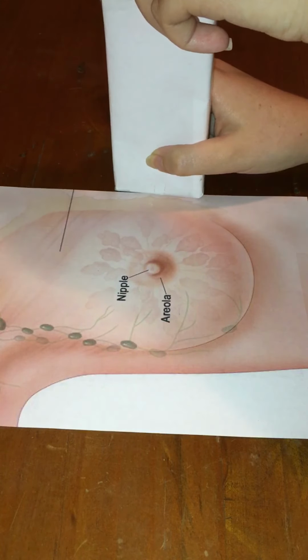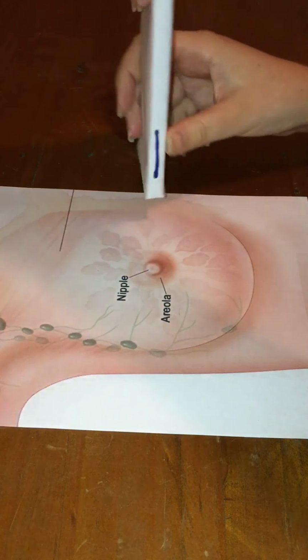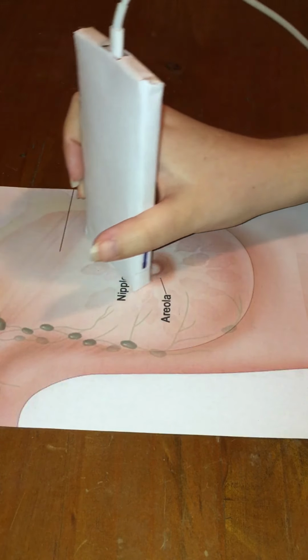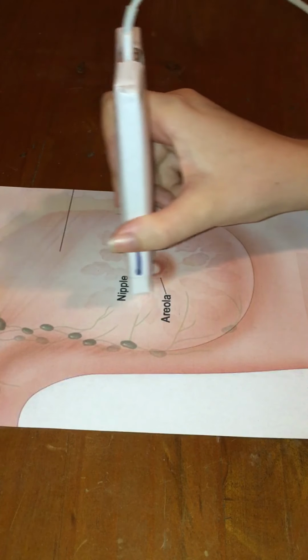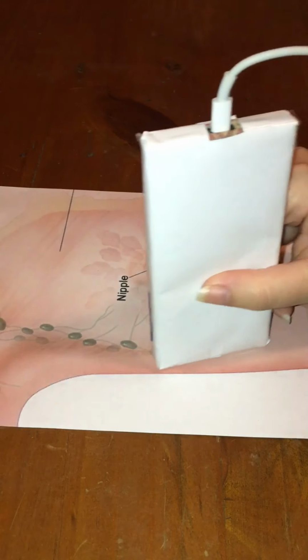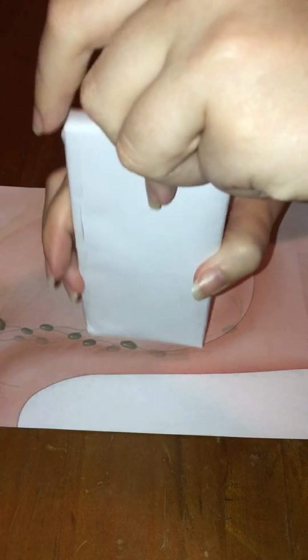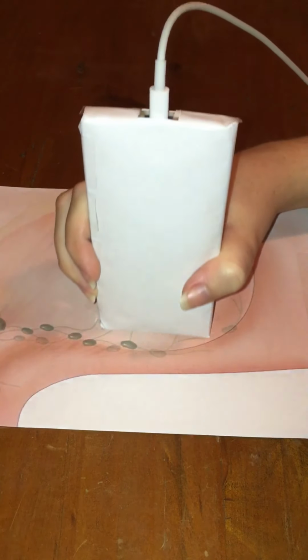At about 3 o'clock, I change the transducer position so that the marker is always pointing towards the patient's right. At about 9 o'clock, the transducer position will need to be altered again so that the marker is still facing to the right side of the patient.